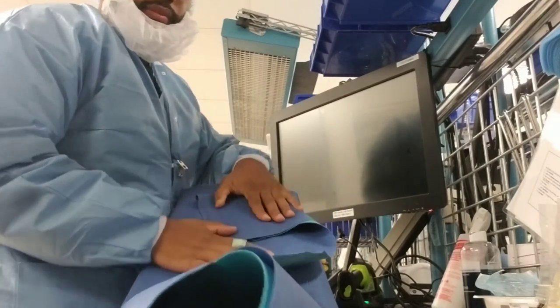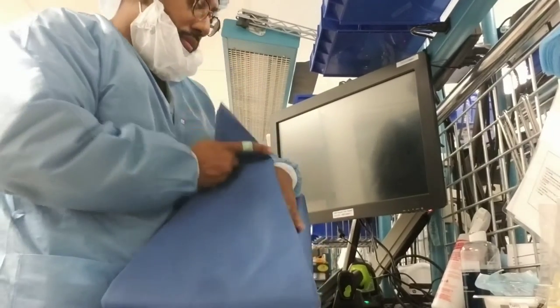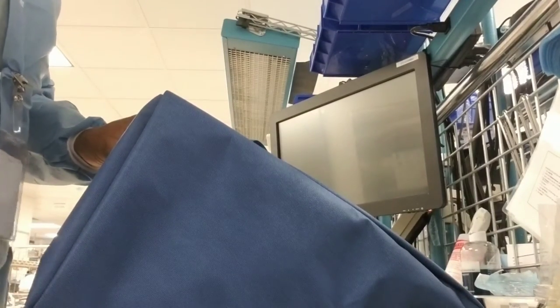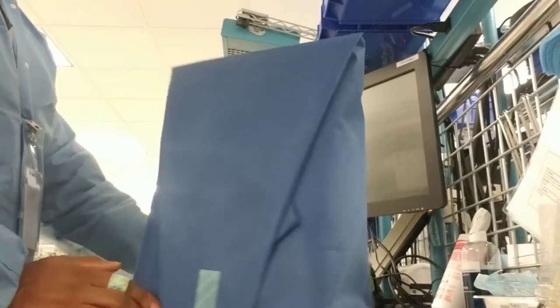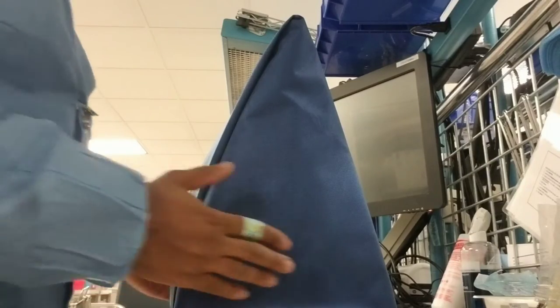And to be honest with you, that's like the easiest way to do it. I've seen other people do it other ways, but this is like the most proficient way. And not only that, it's a lot easier to do. It takes a lot less time to do. But like I said, many hospitals are different. This facility would prefer you to have all three triangles in one. Strange, but that's how they want it. And whatever they want, they will get.